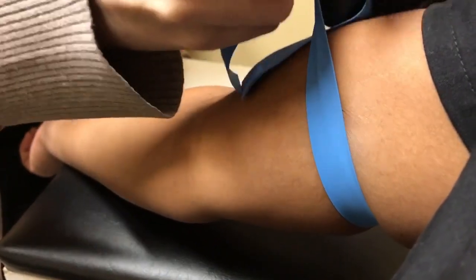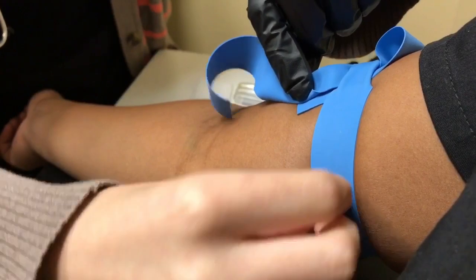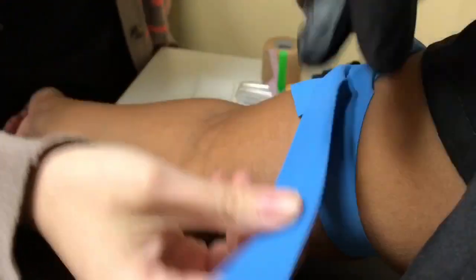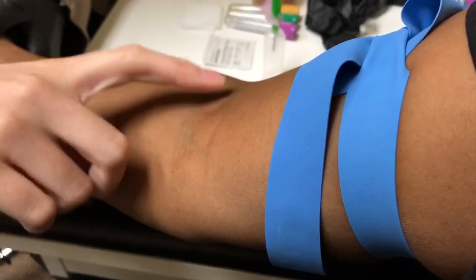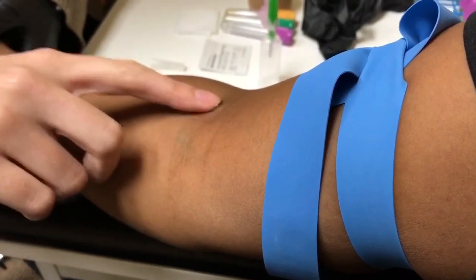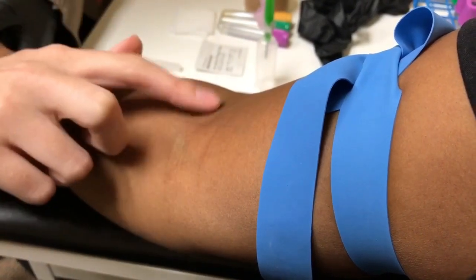I always make sure that the tourniquet is nice and flush and it doesn't roll over, because that doesn't feel very good. And then I'm going to tell her to make a fist and hold it. I'm going to palpate the vein. She has a pretty good vein — you feel a little bit of pushback; it's almost sponge-like.